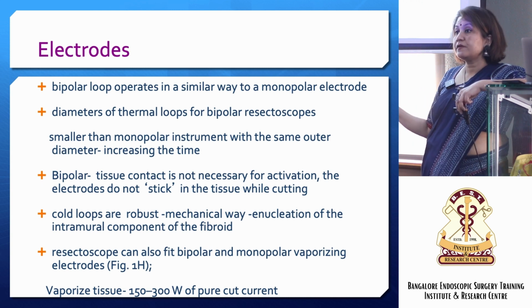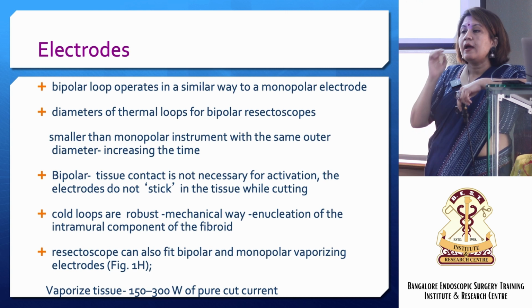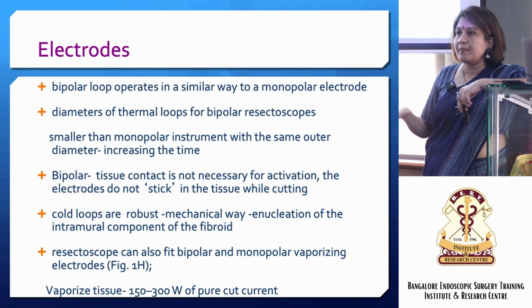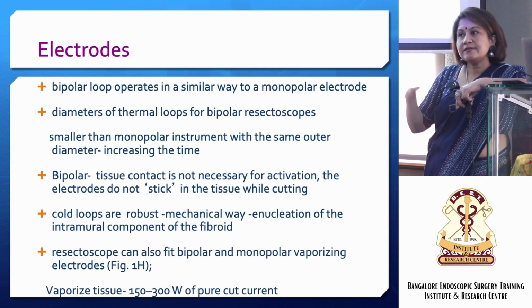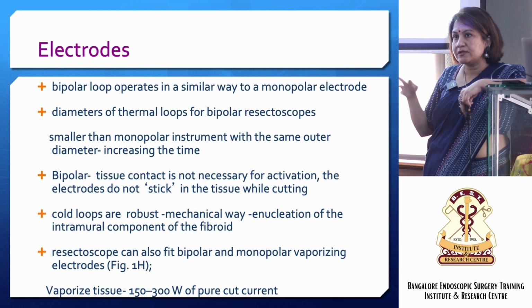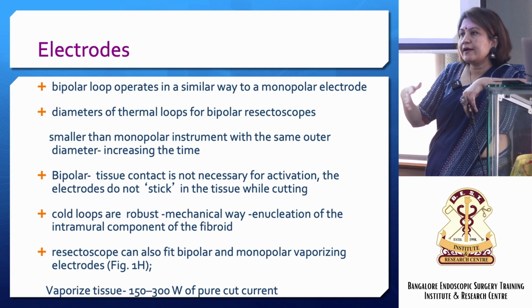But when you are doing operative hysteroscopy with saline, you need an underwater cutting system. So if you are working in a hospital where the urologist is also using a bipolar system, it's useful. Again, same return on investment. They will ask you twice to buy this equipment, because it's much more, definitely 1.5 lakh versus 4-5 lakhs. The hospital will question you.